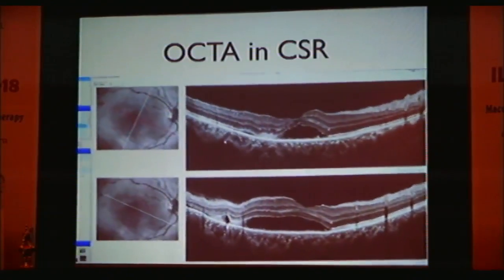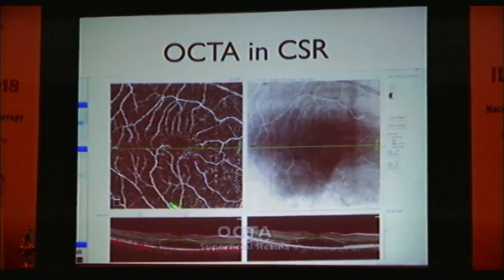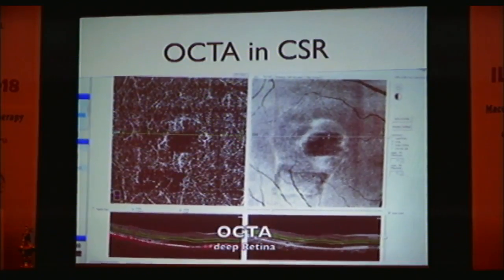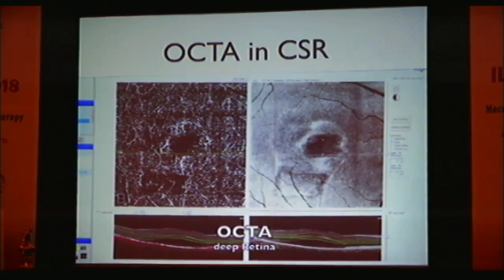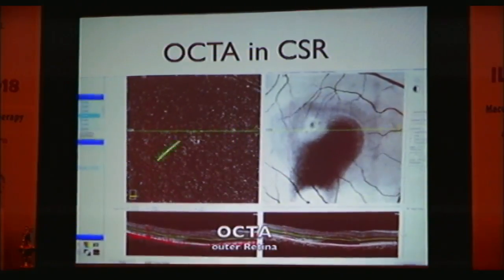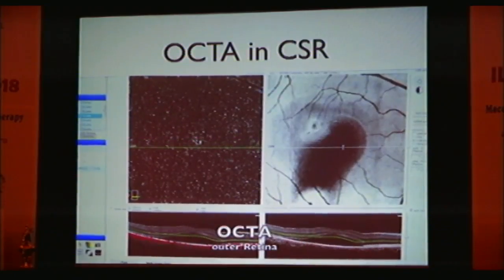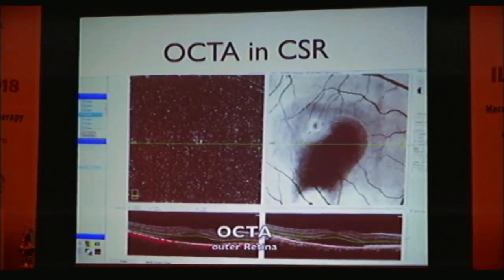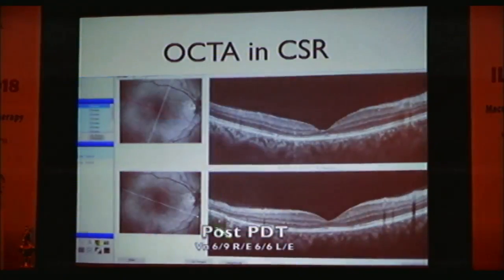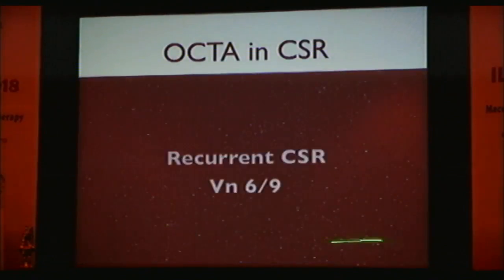Now move on to another modality to be used for this indication, where the patient either has bilateral chronic CSR. You can look at these ragged margins, fuzzy edge. This patient had bilateral CSR, and if the patient has already thinned out the retina in one eye and the other eye is already very scarred, you can do this. So you have these dark areas there in the outer retina. This is the outer retina. You can know the extent. This is the outer retina, and this is the choriocapillaris layer. But the pachychoroid is more visible in the line scan.